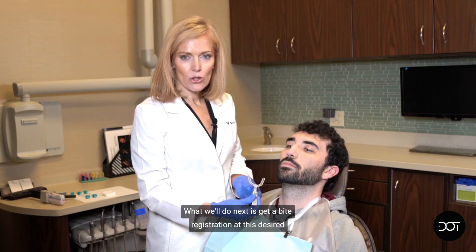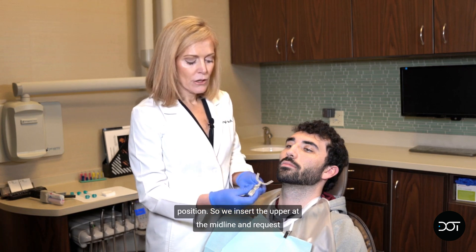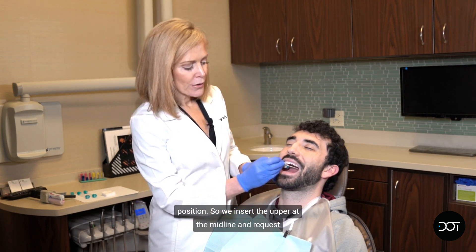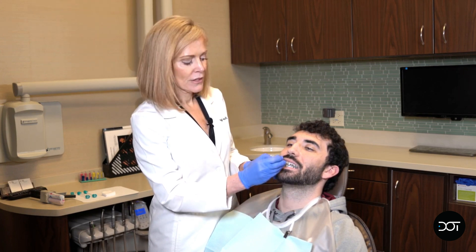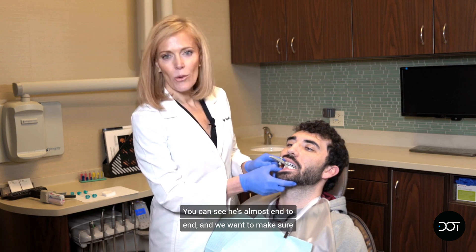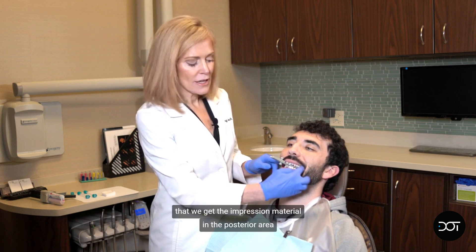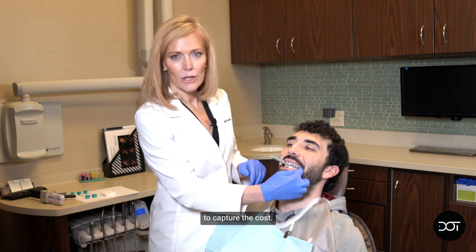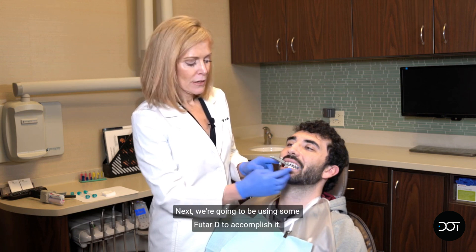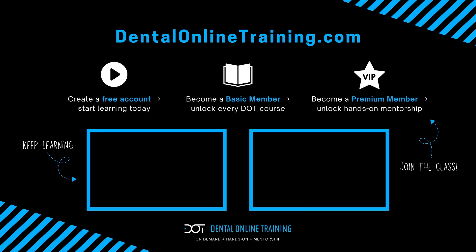What we'll do next is get a bite registration at this desired position. We insert the upper at the midline and request the patient bite down. You can see he's almost end to end. We want to make sure that we get the impression material in the posterior area to capture the cusp. We're going to be using some Futar to accomplish that — take a look posterior.